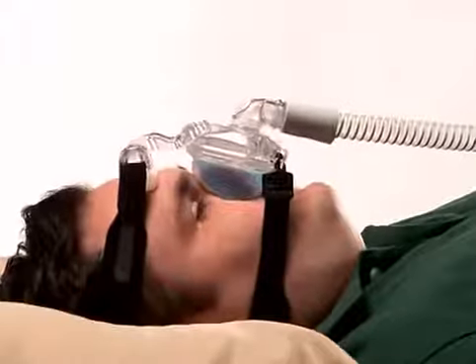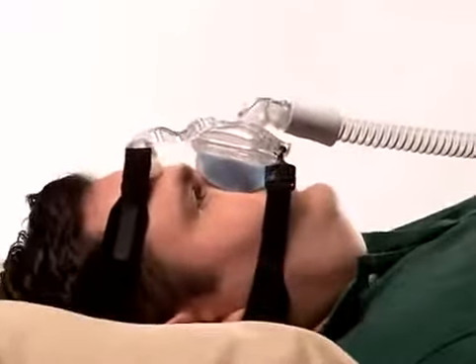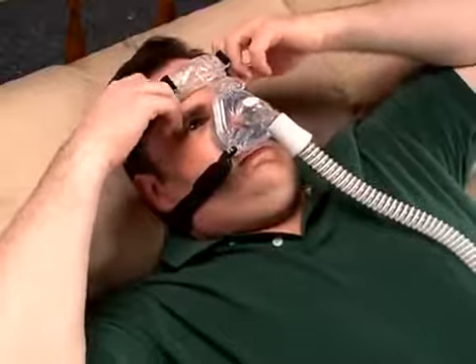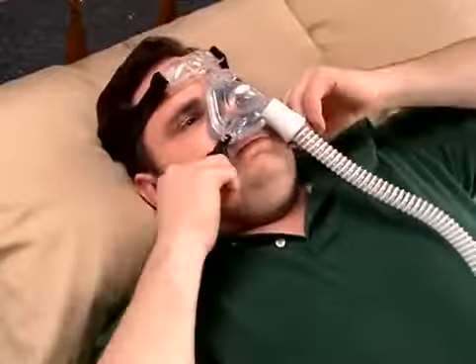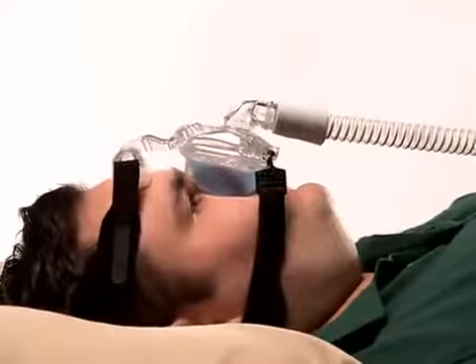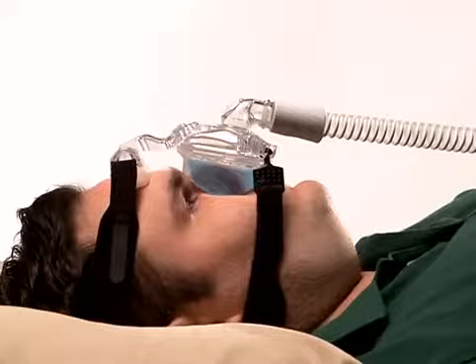With your air pressure at the prescribed level, turn your head from side to side and identify areas of leak that may prevent the ability to sleep. If the forehead pad does not rest lightly against the forehead, gently tighten the top headgear strap. If necessary, adjust the bottom headgear strap so that the mask is snug but comfortable against the face. Again, be careful to avoid over-tightening the headgear.